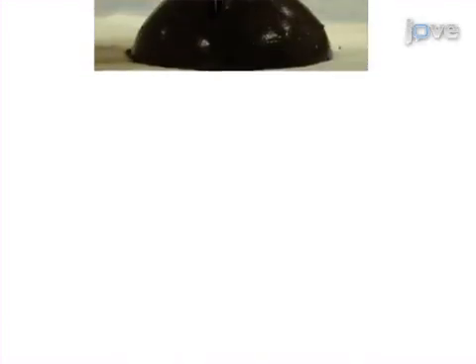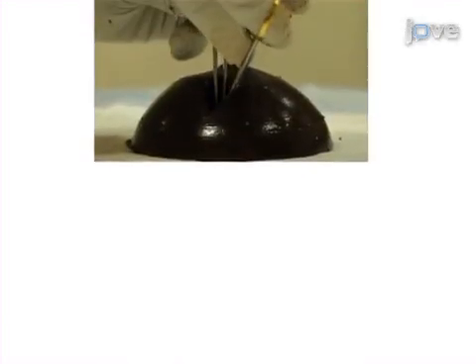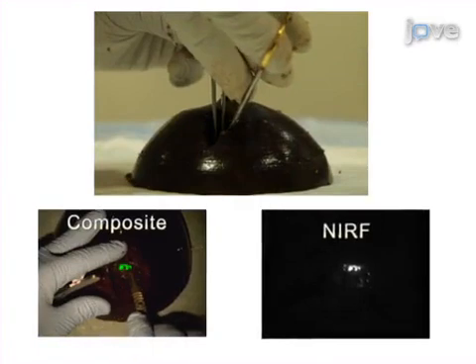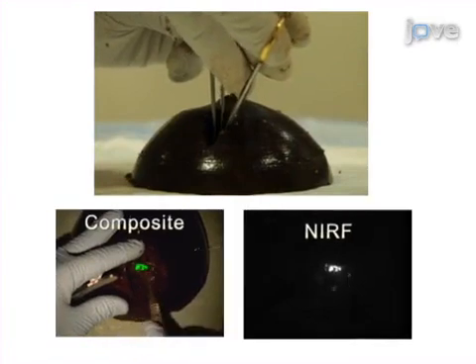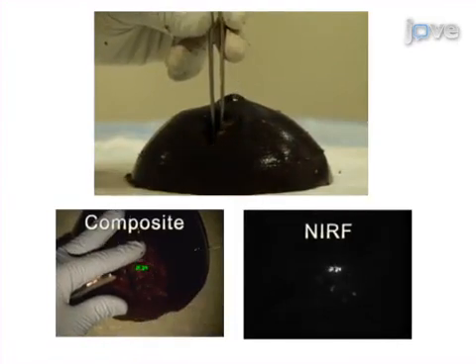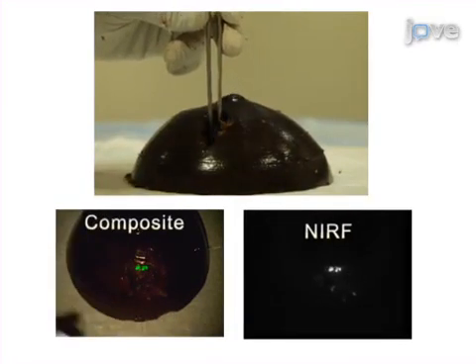If applicable, the surgeon can then excise remaining tumor tissue guided by the near-infrared fluorescence imaging system.